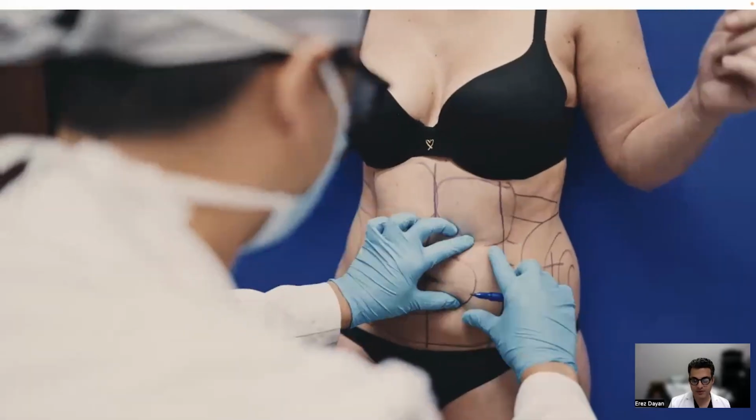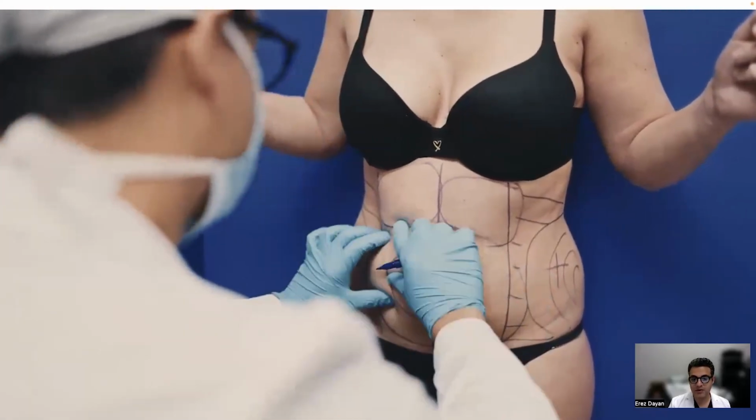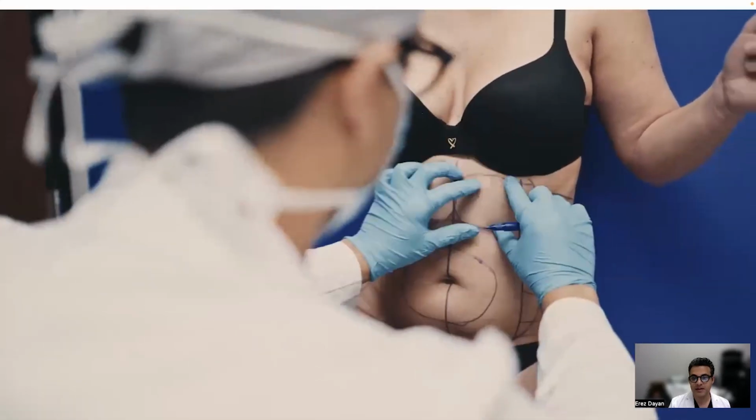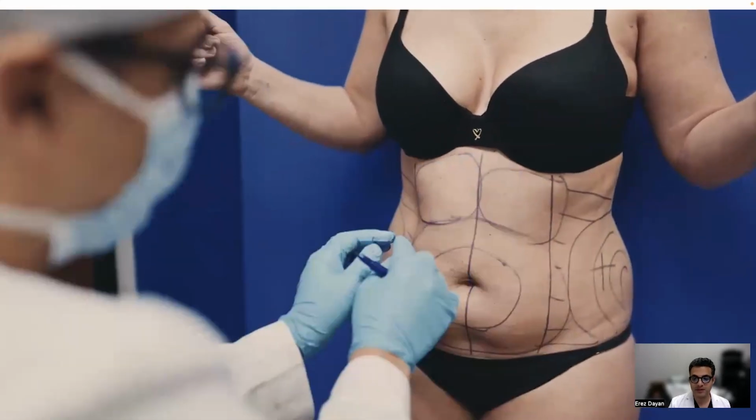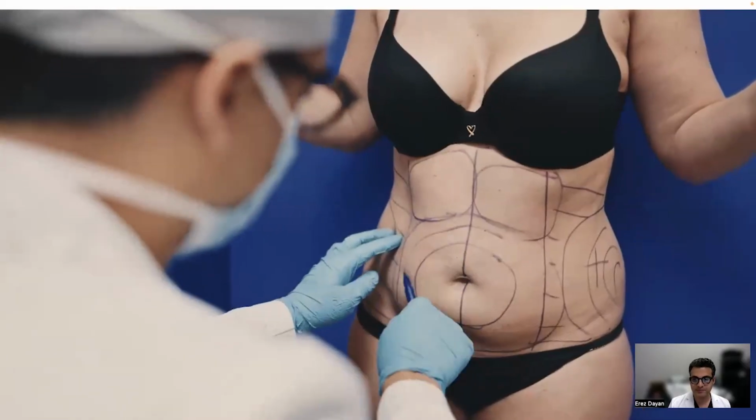So here you can see I'm performing a skin pinch test, and my pinch here is about 2 finger breadths, so I know there's enough subcutaneous fat where we're going to make a meaningful difference. The other thing you can do is have the patient flex their rectus abdominis muscle and get a sense of how much of a diastasis there may be. So if the patient flexes and everything really sucks in very hard, that means they have more of a diastasis and something you want to be aware of.